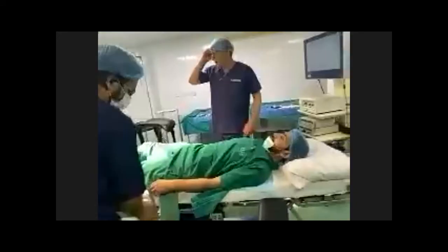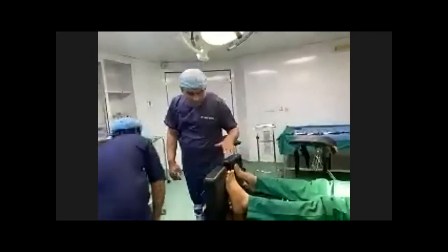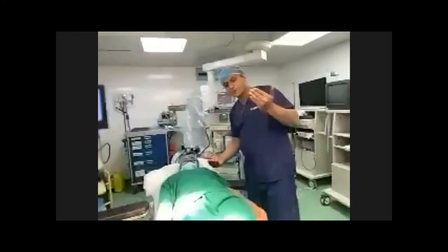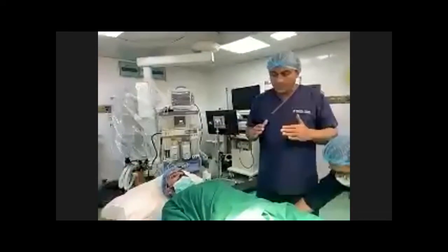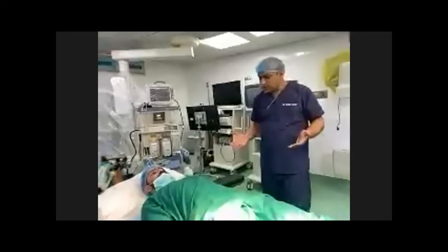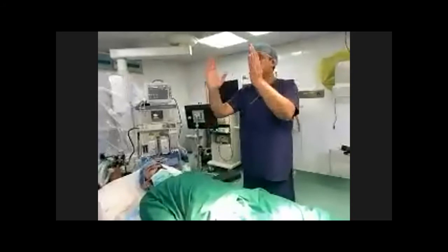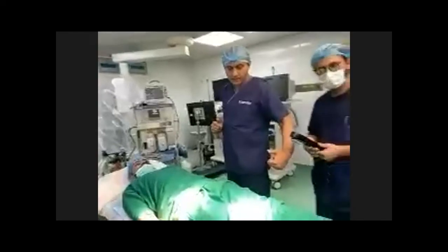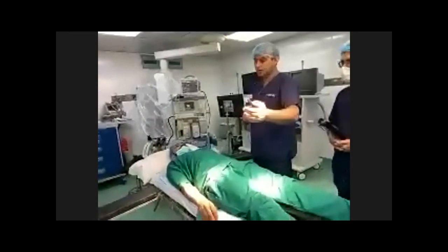Now I will quickly give you an account of where the surgeon will stand during these procedures. So these were the different table positions, and in the lithotomy position, you have to have a bit of Trendelenburg position, that means 25 to 35 degrees head down. In laparoscopic cholecystectomy, the surgeon usually stands on the left side, and the laparoscope is in front of the surgeon. The cameraman stands on the left of the surgeon, and one assistant, a scrub nurse, stands in front of the surgeon on the opposite side.